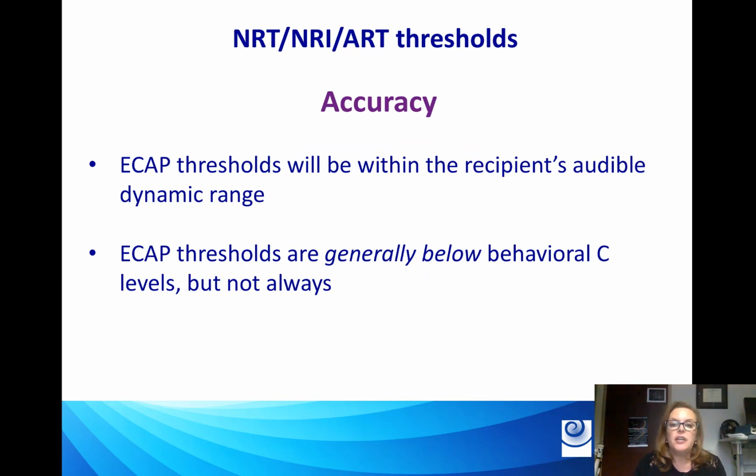Now, as I mentioned earlier, this is the objective measure that most people use and most people are familiar with. And I think it's really important for everyone to be aware, if they're going to use this, of what the accuracy of the ECAP measure is.